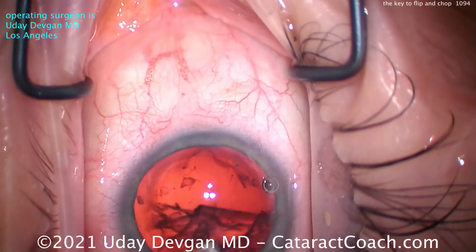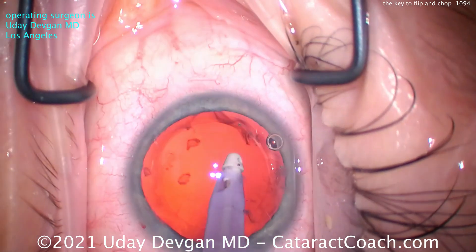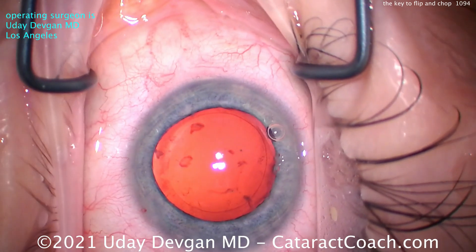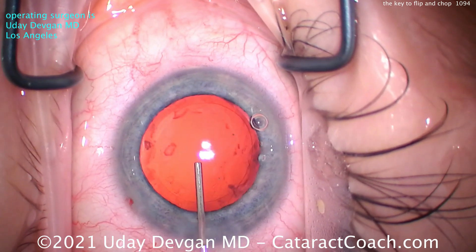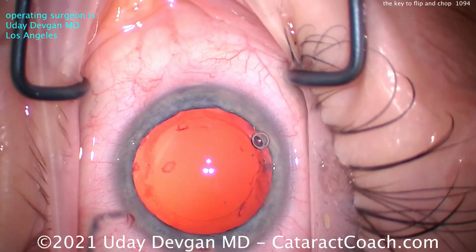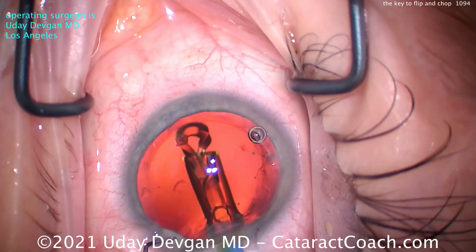Coaxial irrigation-aspiration. My technician is loading up our lens. With prior LASIK, we're always going to use a monofocal aspheric lens because she had a large degree of myopic ablation. Her corneal power is 36 diopters — it's not going to be great to put in an EDOF, multifocal, or trifocal lens. So don't do it; stick with the monofocal.